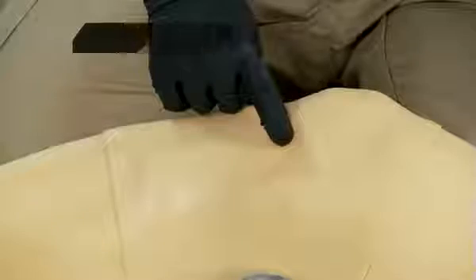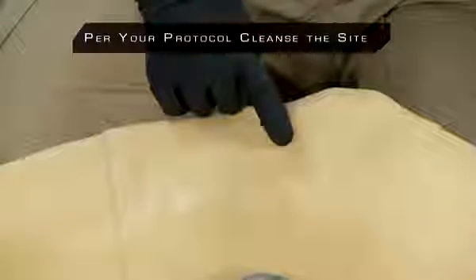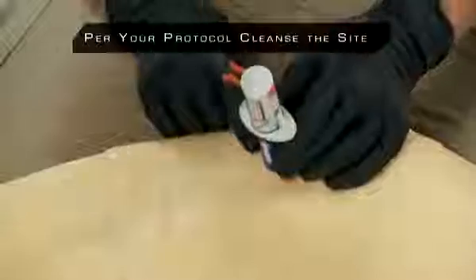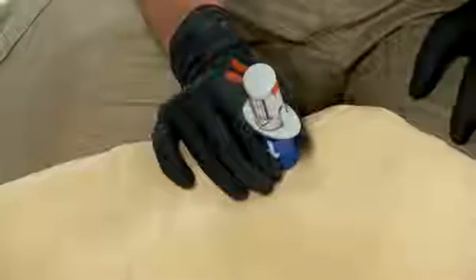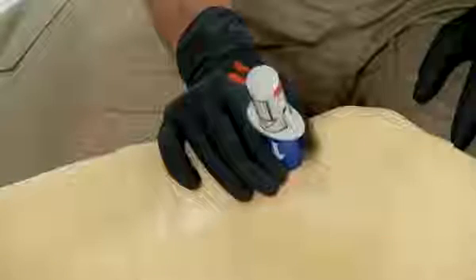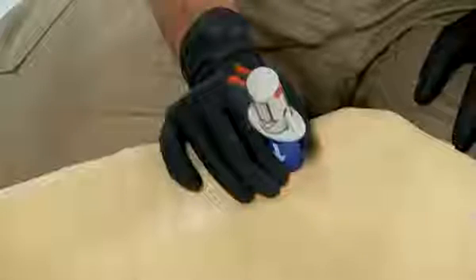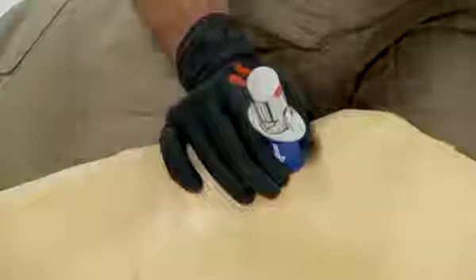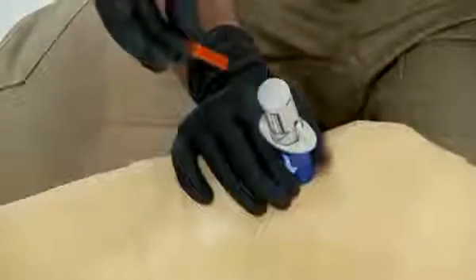Once placement and depth are determined for either device, use your non-dominant hand to hold the red or blue barrel firmly at the penetration site. Hold the BIG at a 90-degree angle using aseptic technique throughout. Lay the palm of your hand on the leg while holding the BIG in place to add stability. While holding the barrel firmly, pull out the red safety latch with your dominant hand by squeezing the two sides together.